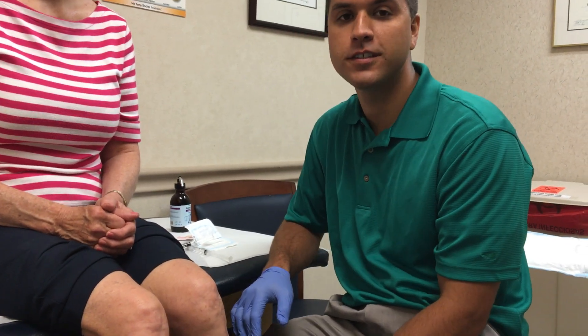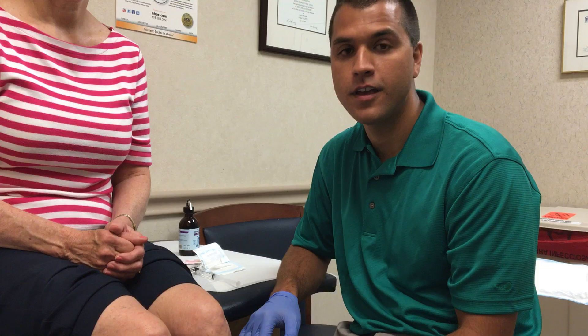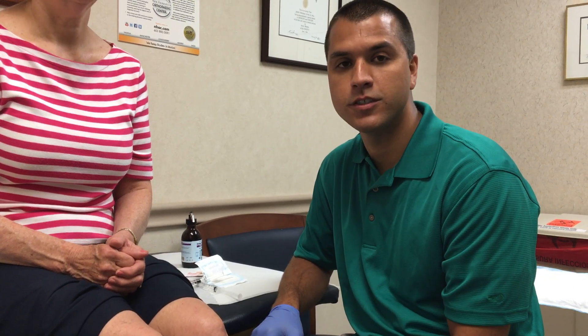Hi, my name is Dagan Kludier, Physician Assistant, and I'd like to demonstrate how I administer a visco-supplementation injection.